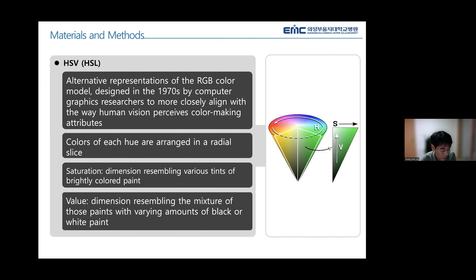The value dimension resembles the mixture of paint with varying amounts of black or white paint added.